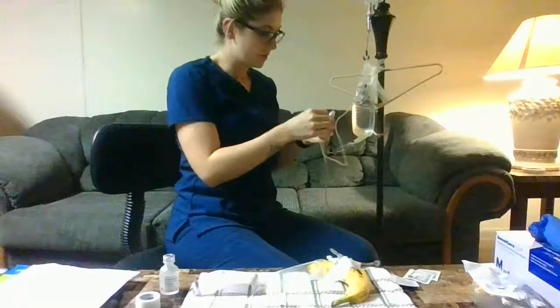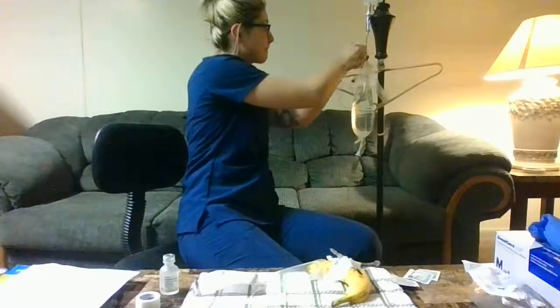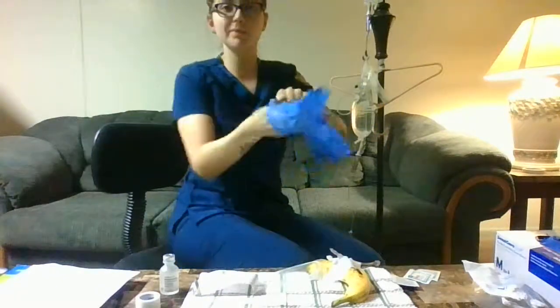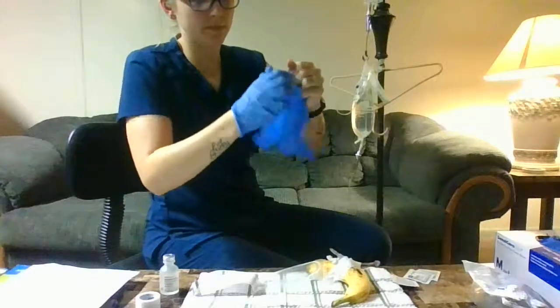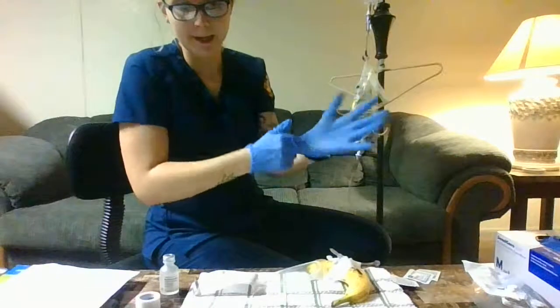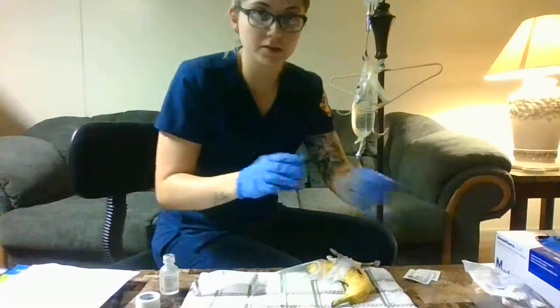get our alcohol swabs. We can get some gloves on. We have our alcohol swabs.